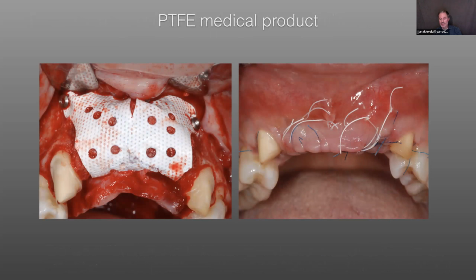Now, this material is polytetrafluoroethylene. Many of us are familiar with this. If you're a surgeon, membranes and sutures are made out of PTFE. PTFE is a textile, and it can be made as a medical textile, and it's used for various designs in dentistry. It's used in medicine to create vascular stents. And outside of medicine, everybody knows if you have a Gore-Tex ski jacket, that's also PTFE.